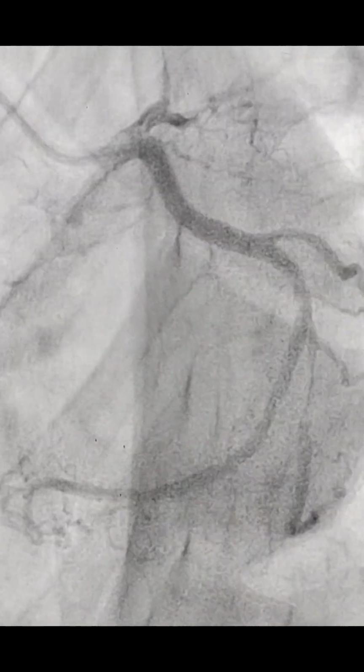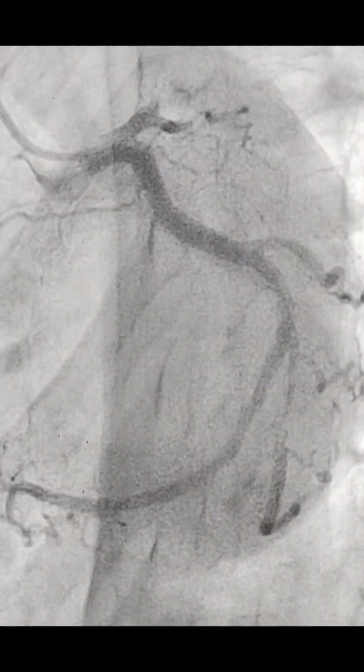This is a 62-year-old male patient, known case of diabetes and hypertension, now presented with ST elevation MI in II, III, aVF, V5, V6, and aVL leads. You can see there is a thrombotic lesion in the OM2, and there is a 100% occlusion in the LAD.